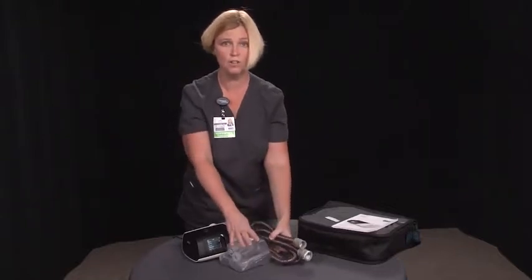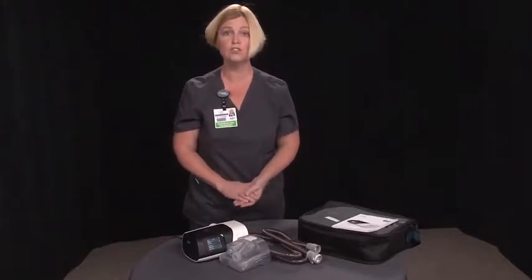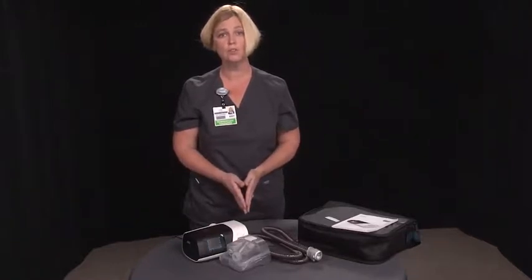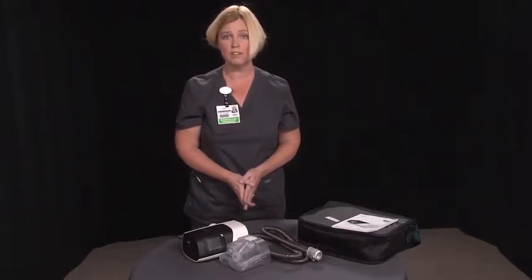Again, you will clean the tubing, water chamber, and your mask and headgear one time per week. The filter you will change once per month. You are also eligible to replace your supplies on a rolling 3-month basis. Someone from our resupply team will reach out to you about 6 weeks after your setup to see how you prefer to be contacted. There is an app, email, or text available for this contact.